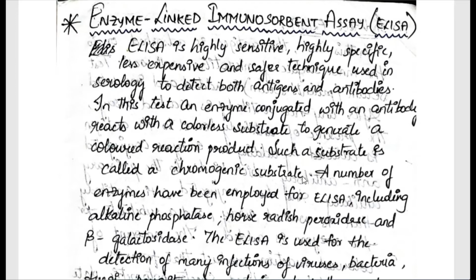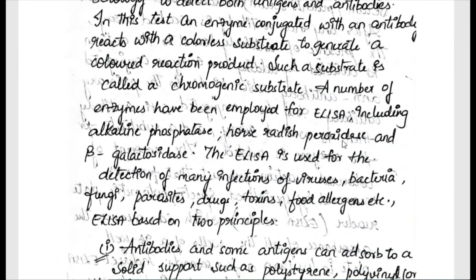A number of enzymes have been employed for the ELISA technique, including alkaline phosphatase, horseradish peroxidase and beta galactosidase. These are the three main enzymes employed in the ELISA technique. And as I told you, the ELISA technique is used for the detection of many infections of viruses, bacteria, fungi, parasites, drugs, toxins, food allergens, etc.